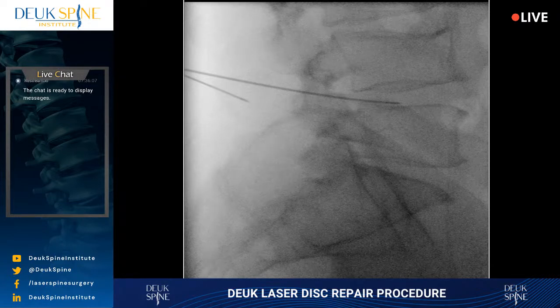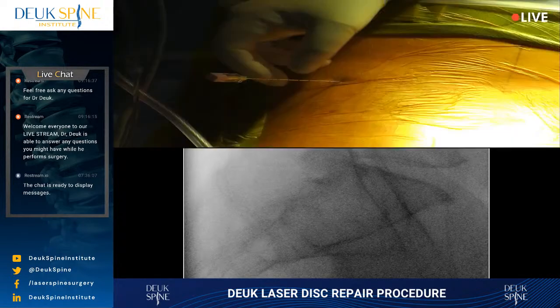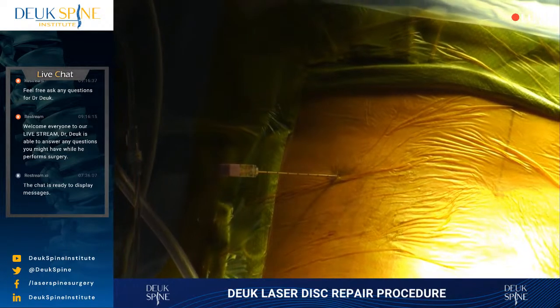So think of it as trying to get a profile. That may be our best. It looks like it's the best one that I've seen. What do you guys think? So think about what we're trying to do: get a profile of a person, right? You've all seen profile pictures of people. What you see is the chest, side view, perfectly profiled, the head, the neck. But imagine doing a profile silhouette or side view of somebody whose head is turned, but their body's not. Their body's forward, the head's turned. So now you're going to change your camera angle to get the head in profile, but then the body and chest are not, right? Because they're twisted relative to the head. That's what happens with scoliosis. So we're sitting here trying to figure out the best angle, but we're dealing with rotational issues of the spine.